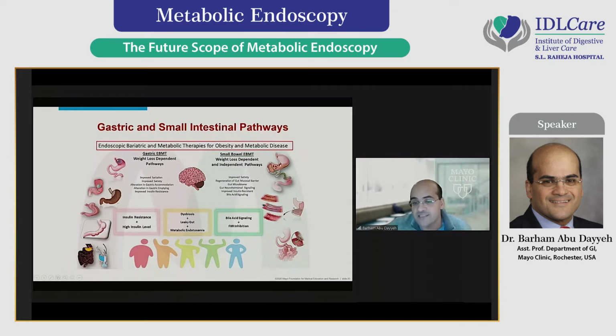And there are devices that affect the small intestines that work on the gut mucosal barrier, gut microbiome, gut neurohormonal signaling with the central nervous system, with the end product that collectively these weight dependent and weight independent effects are improving insulin resistance, correcting the state of dysbiosis and leaky gut, and improving metabolic health.